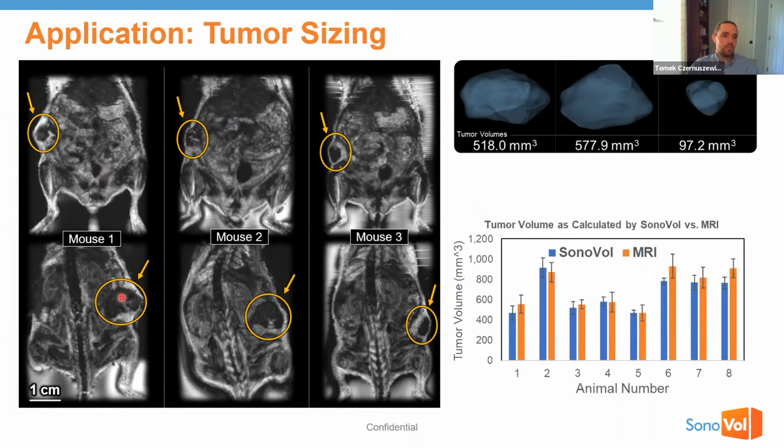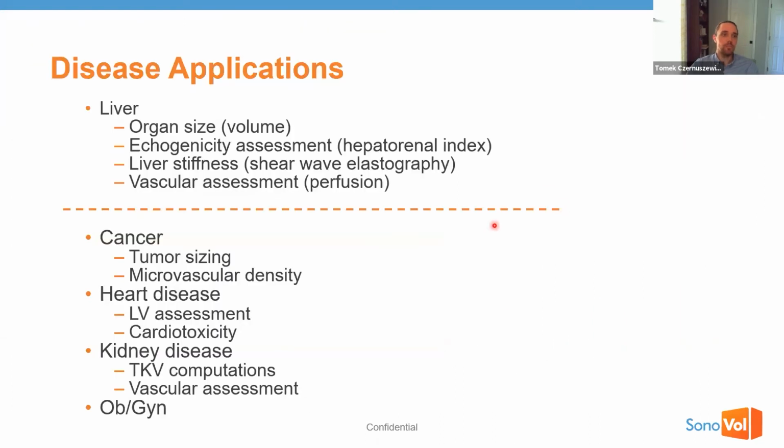Here you see some examples of different imaging poses on the system. Here's the liver up here, this dark area. We can see the stomach. The tumor is here on this particular subcutaneous model that we were looking at. You can see the legs, and it's pretty easy to interpret what's happening in these images and know what you're looking at when you have this wide field of view.